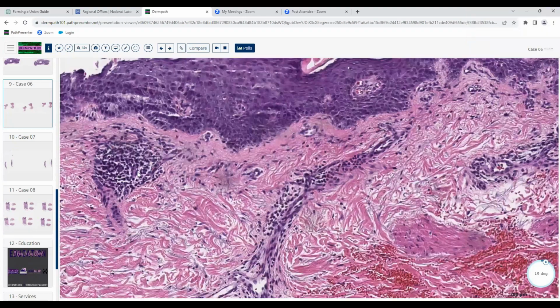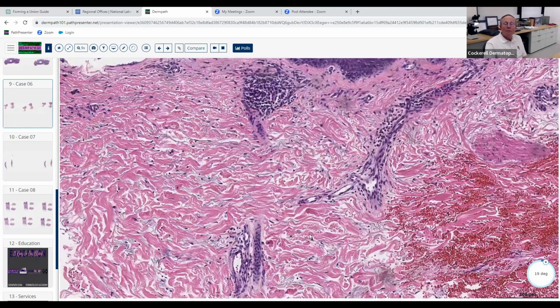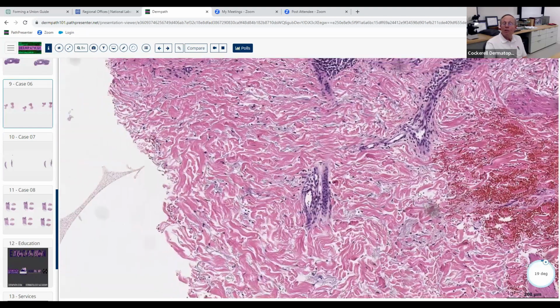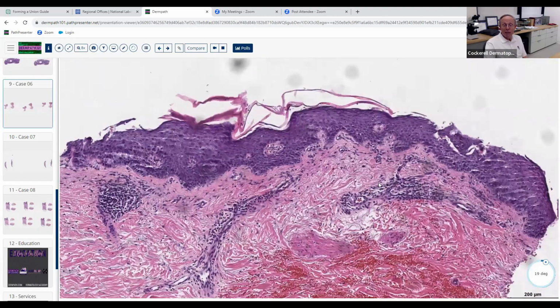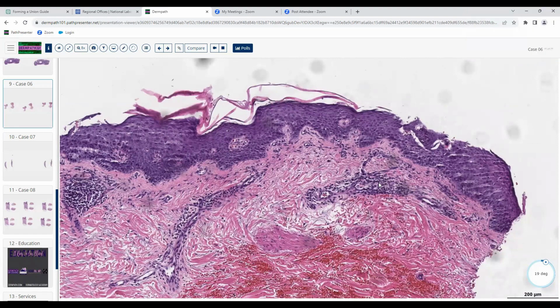And let's take a look. These are lymphocytes, so we didn't get fooled at low magnification. Well, I don't see any eosinophils. This is more solar elastosis, so I really don't see too much in the way of mucin here. So can we make a specific diagnosis of this? No. So if they sent this in to us as rash, we wouldn't be very happy, would we?